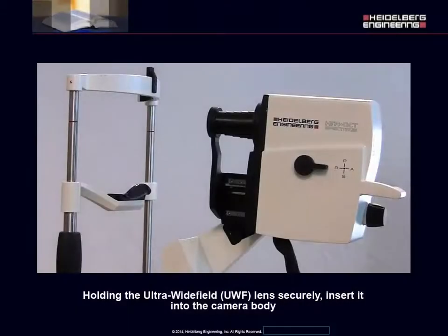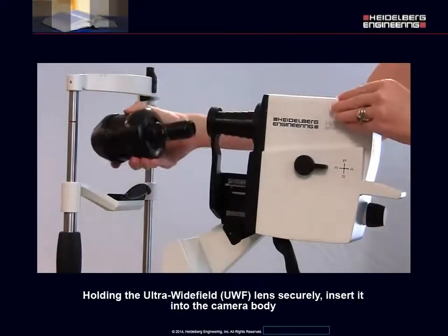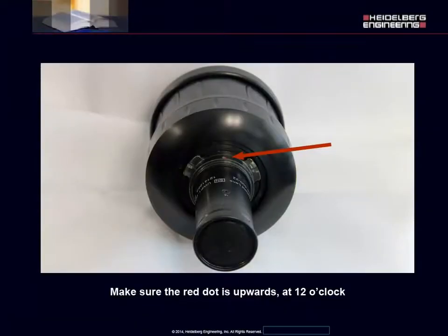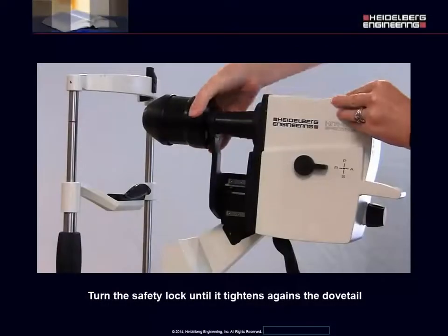Holding the ultra-wide field lens securely, insert it into the camera body. Make sure the red dot is upwards at 12 o'clock. Turn the lens clockwise until it clicks. Turn the safety lock until it tightens against the dovetail.